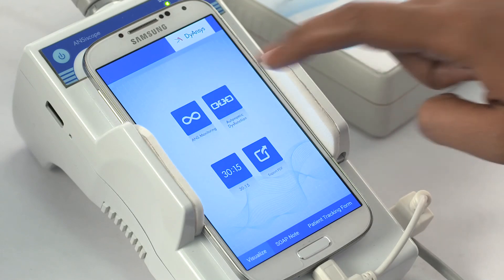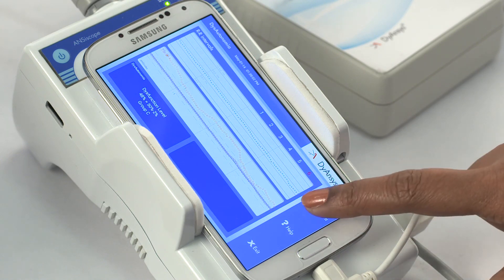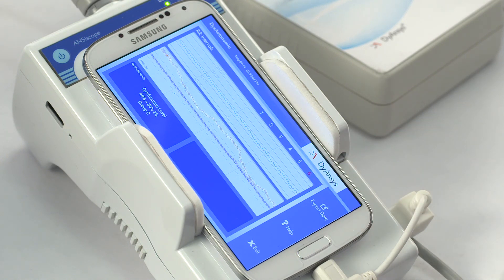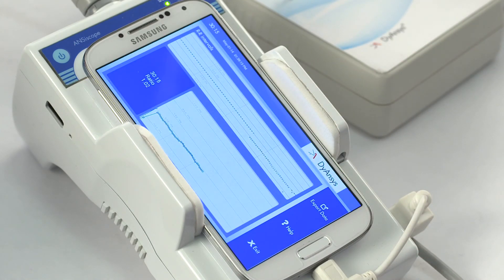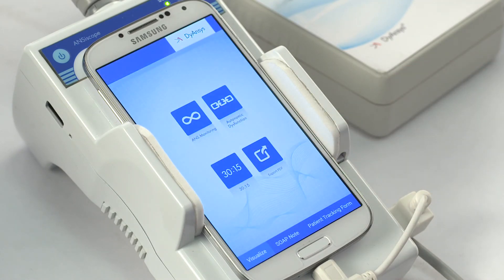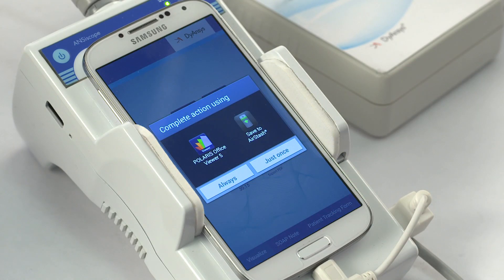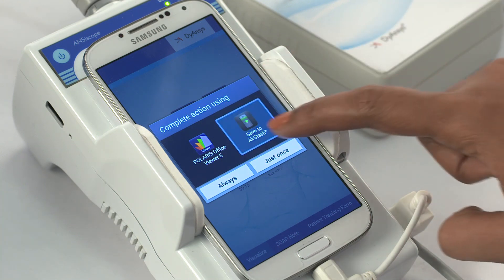Select the autonomic dysfunction icon to view the dysfunction percentage, balance, and graph. Press export data. Exit the screen. Press the export PDF to transfer all data including ANS, AD, and 30-15 in PDF format to Airstash.